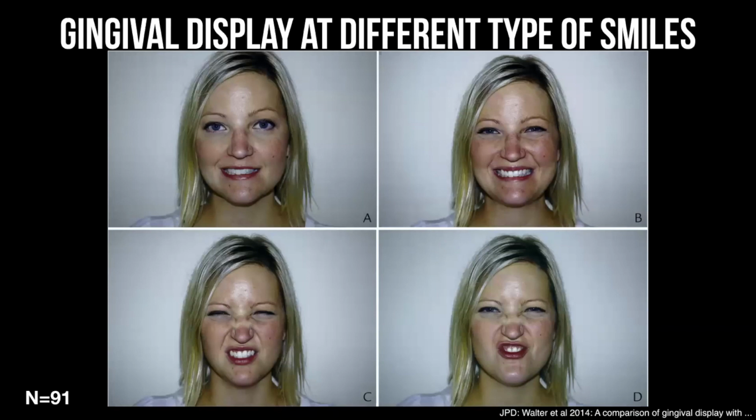On the other hand, traditionally we're all taught about a smile and then we mark it. But remember, we are human beings, and we are not only doing a smile. We do a lot of mocking, we do a lot of gestures, and we make a lot of shapes with our lips. You need to evaluate each of those and make sure in all of them you fully cover the prostheses and your dentures underneath the lips, and lips will hide everything for you, and you can do whatever underneath it.